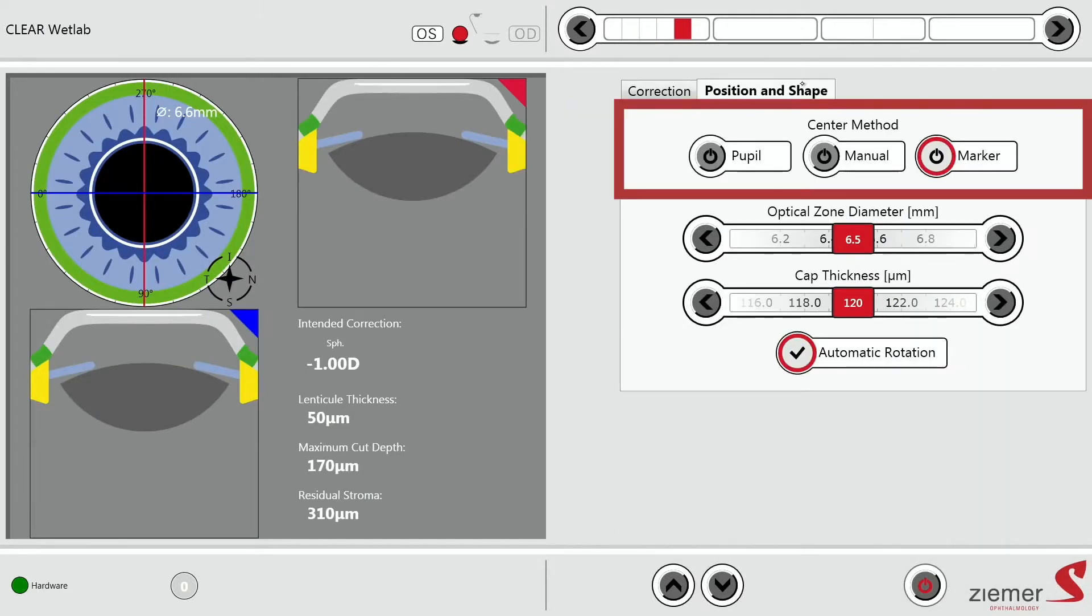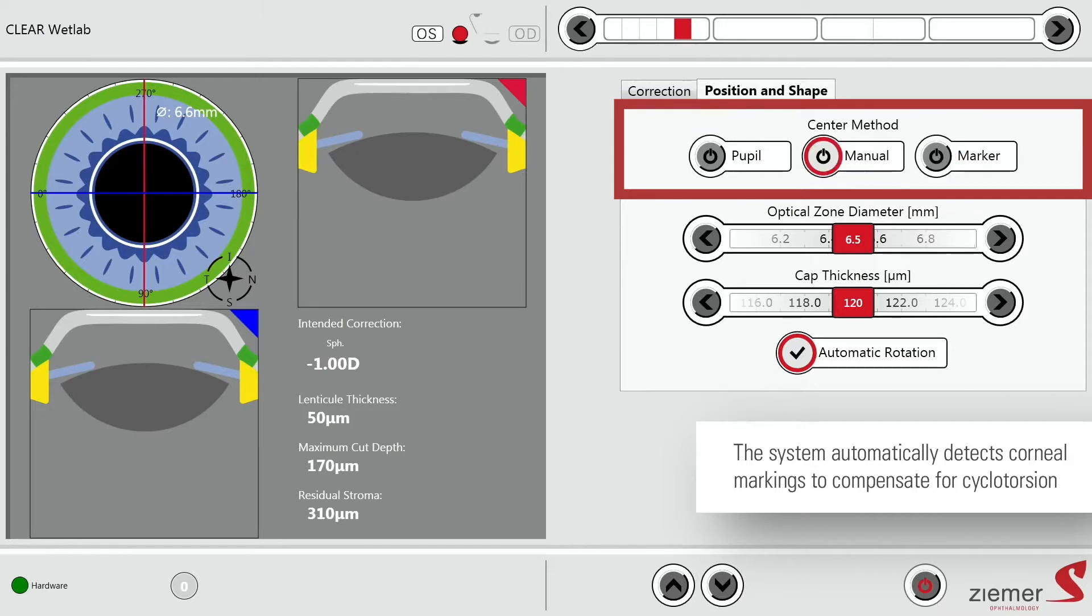Here for the centration method, we offer with the Z8 three different options. We have the pupil, we have the manual, and we have marker. So if you mark the cornea with the software, we will be able to detect those and adjust centration and cyclotorsion. Those are unique with our Femto LDVZ8.